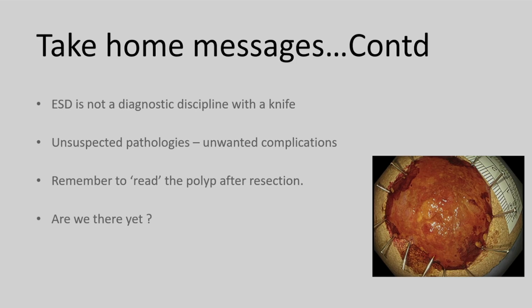ESD is not a diagnostic discipline with a knife. It is a curative, it is a therapeutic option. I hate the word when people say, can you do diagnostic ESD? There is nothing called as diagnostic ESD. And if you have unsuspected pathologies, if you're not confident in the pathologies, you may have unwanted complications. You need to remember that. And remember to read the polyp after resection.